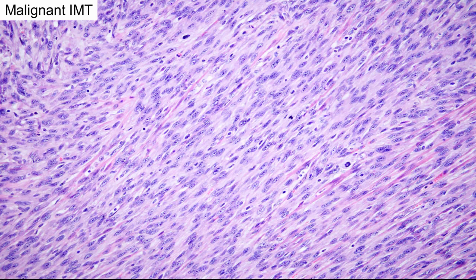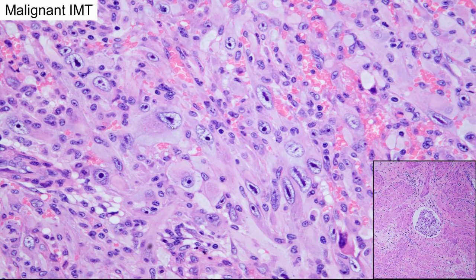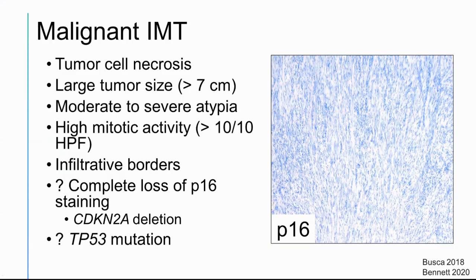So malignant IMTs are, of course, very difficult in some cases to diagnose. It's easy when you have extrauterine disease at diagnosis or the tumor looks markedly atypical. As you can see, it's hypercellular here. There's brisk mitotic activity and these enormous pleomorphic nuclei with prominent nucleoli. Also, you may see lymphovascular invasion or necrosis. However, IMTs have also been shown to recur, which is a problem spot in GYN pathology. So one review article gave suggestions for when to diagnose a tumor as malignant.